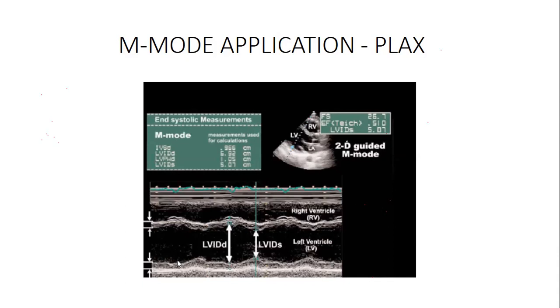It's in synchrony with the left ventricular posterior wall. When the septum is in systole, also the posterior wall, because this is the same wall, it's also in systole. When it's in diastole, it goes in diastole.